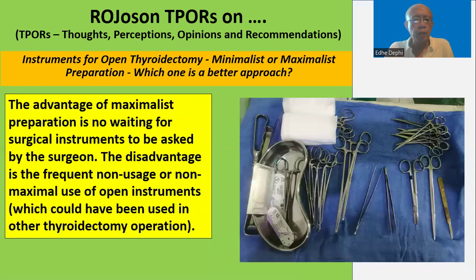The advantage of maximalist preparation is no waiting for surgical instruments to be asked for by the surgeon. The disadvantage is the frequent non-usage or non-maximal use of open instruments, which could have been used in other thyroidectomy operations.